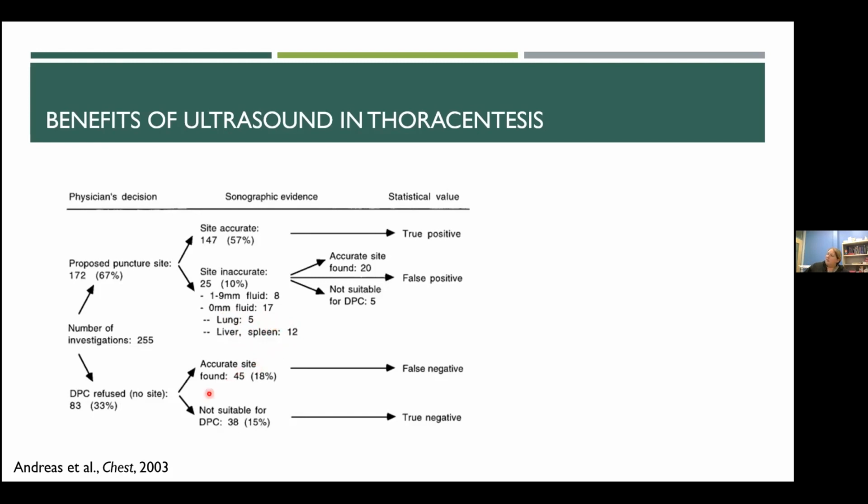They also did the opposite, where there was no site. The physician said, you know what, there's not really a great site here that I can identify. Again, using ultrasound, they were able to actually identify sites in about 20% of those patients. So if there was no landmark-based opportunity, ultrasound was able to identify some.